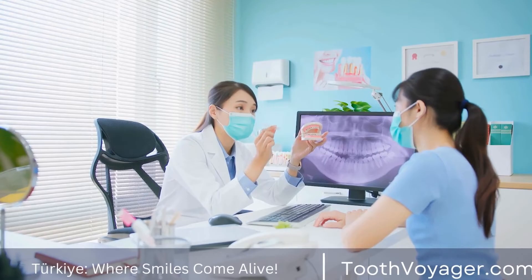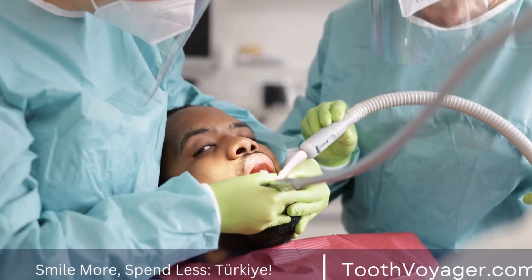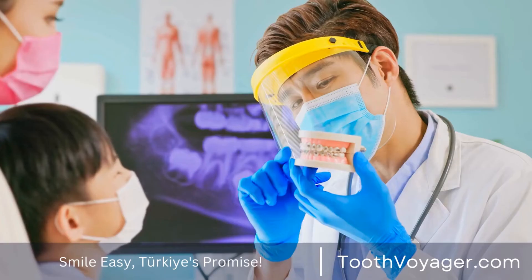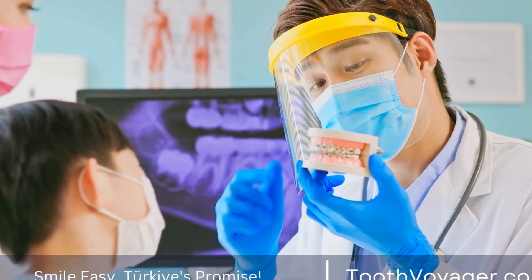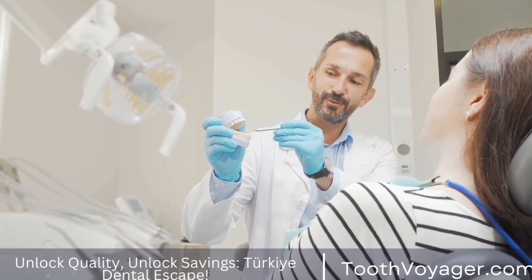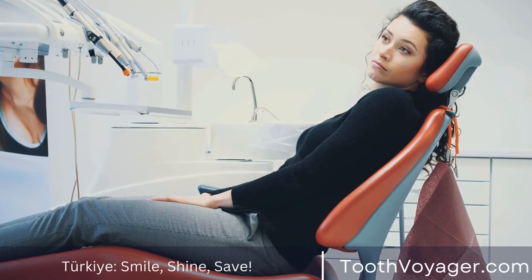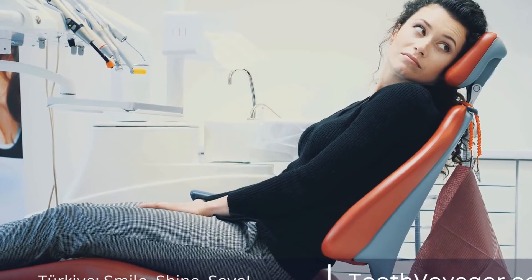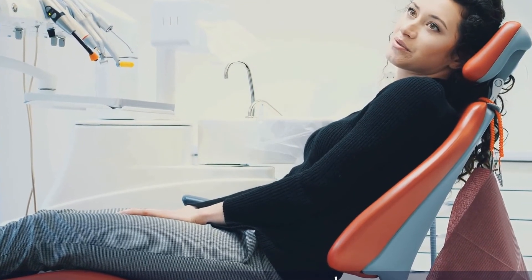Design and Manufacturing. Once the impressions have been taken, the next step is to design and manufacture the veneers. This process may vary depending on whether the veneers are made of porcelain or composite resin. Porcelain veneers are typically fabricated in a dental laboratory. The dentist will send the impressions of your teeth to the lab, where skilled technicians will use them to create custom veneers that match the size, shape, and color of your natural teeth.